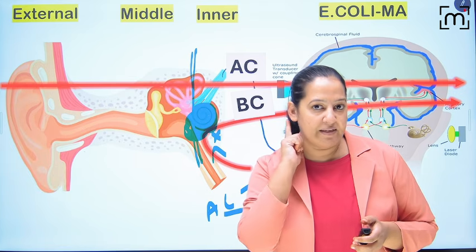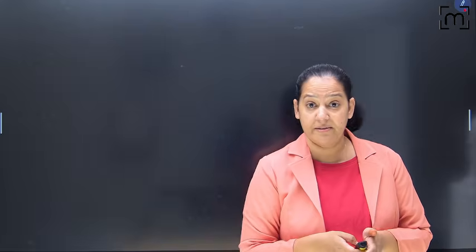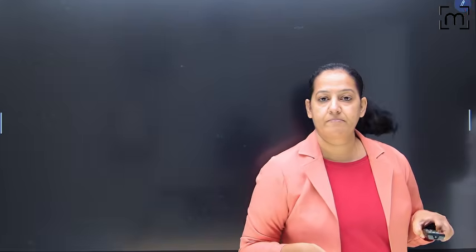whenever the tuning fork is placed on this mastoid, suppose my right ear, can you see? Here I'm having 100% cochlear damage, 100% severe unilateral sensorineural deafness. If I activate it and put it here, I should have zero sensation, because it is not even going to the cochlea, which is 100% damaged.